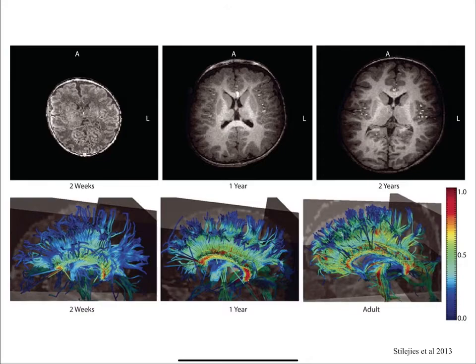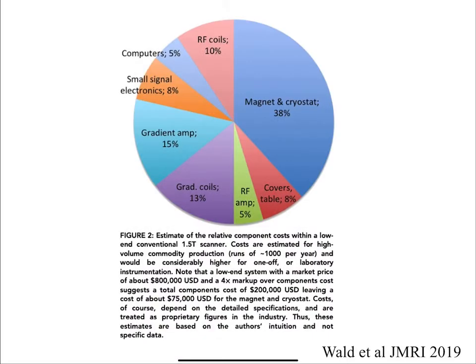So any questions? So those are 2 main ways that we use MRI to look at motion. What we're going to do now is switch gears and talk about the latest advances in MRI and where MRI might be going. So one issue with MRI is right now it's a fairly costly technology. So a standard fully decked out scanner is about $1 million per Tesla.